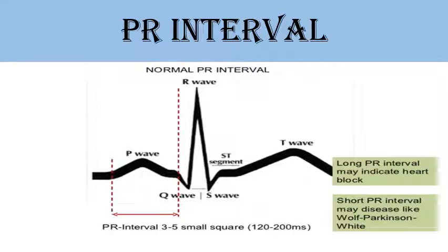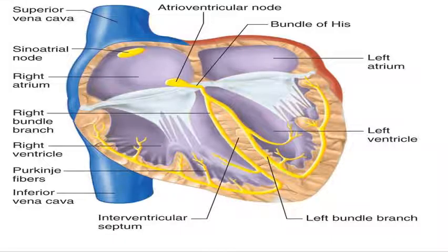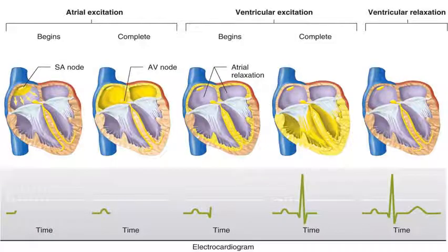Interval of the electrocardiogram. The body fluids are good conductors because the body is a volume conductor. Fluctuation in potentials representing the algebraic sum of the action potentials of myocardial fibers can be recorded extracellularly. The record of these fluctuations in potential during the cardiac cycle is the ECG.